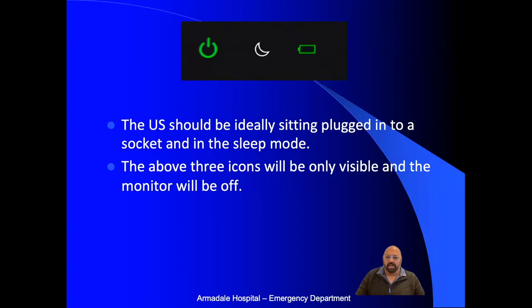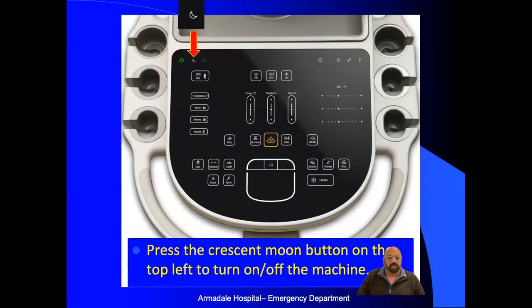This is how you might find the ultrasound machine — it should be plugged in and charging with sleep mode on. The crescent-shaped mode button turns the Spark on and off when it's in sleep mode, and hopefully just those three icons will be visible. Press that button to turn it on from sleep mode. If the machine has been turned off completely, press the green start button. The machine takes around two and a half minutes to start up from being shut down, whereas from sleep mode it starts up almost immediately.